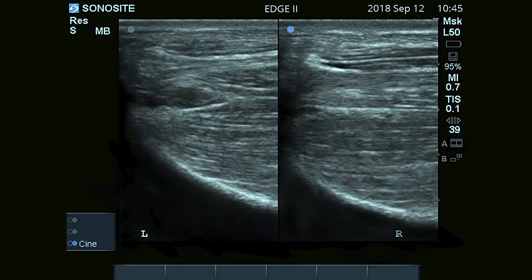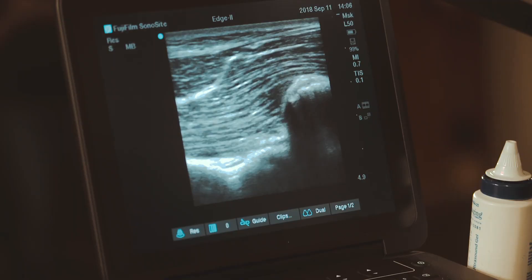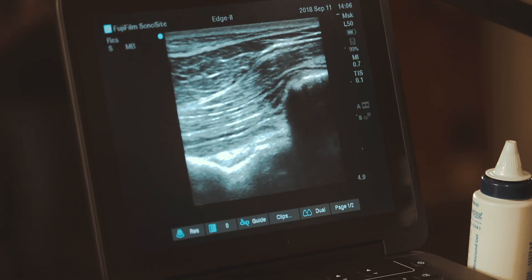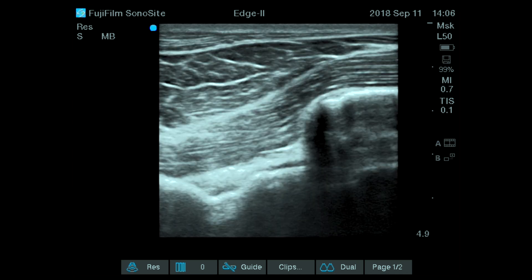On this longitudinal image, we can see from top to bottom: the splenius, the semispinalis muscle, and lower, the nuchal ligament insertion. As we go a little bit more caudally, we can see the first aspect of the joint between the occiput and C1.